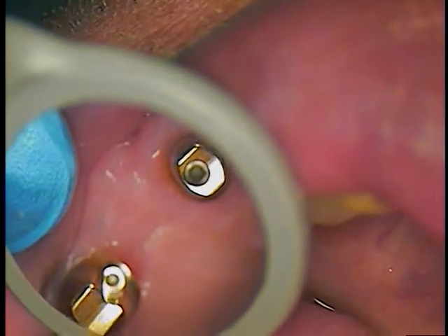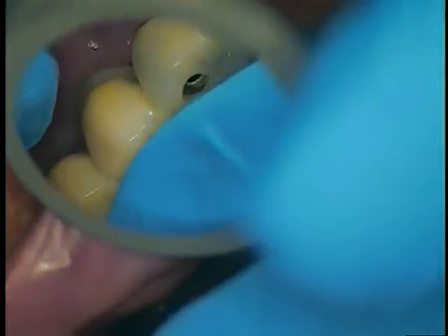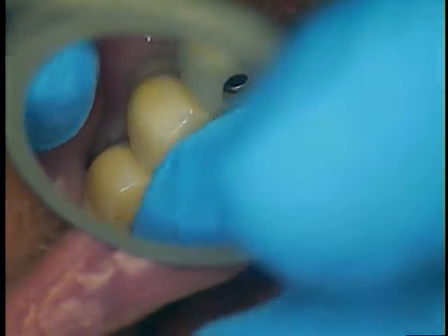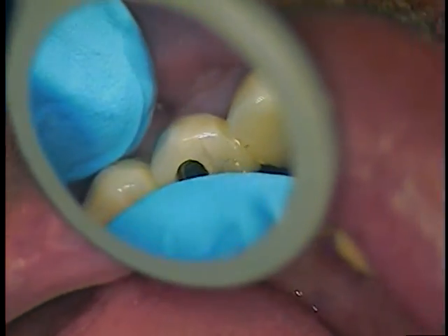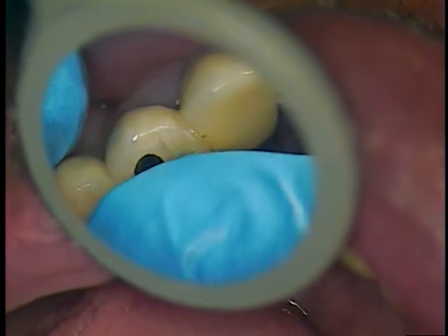There are the screws. When we tried in the bridge, we found out that the occlusion was a little high, so we had to grind the occlusion in. He has a pretty flat plane occlusion — more of a group function. We also found our pontic region was a little bit high water, so we didn't want that, so I added to the pontic — you'll see the excess there — and also to the contact region. We want a nice, flat, broad contact, and we added there.